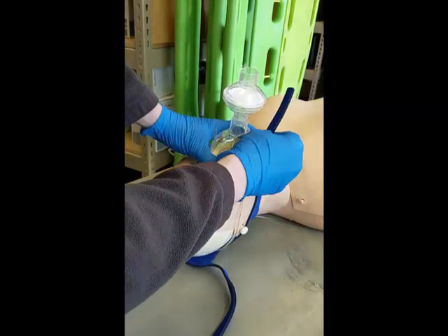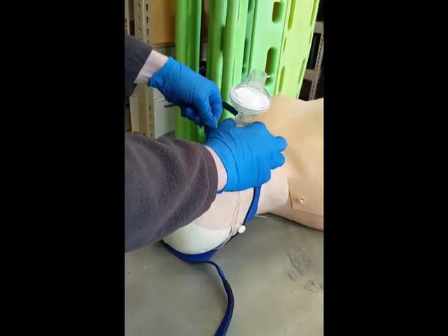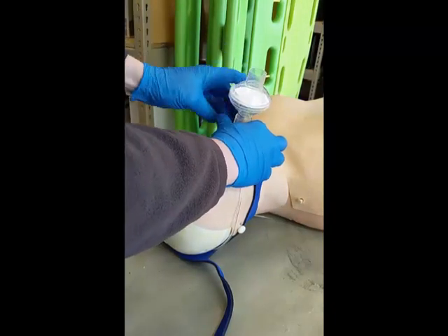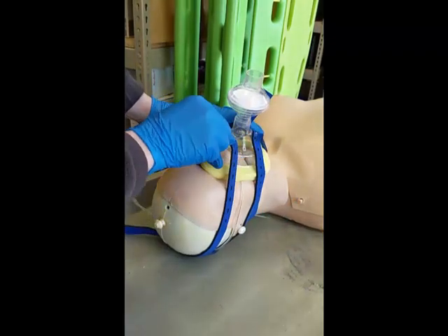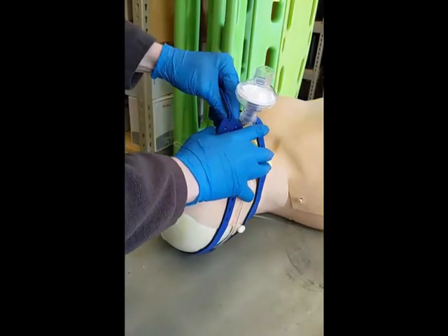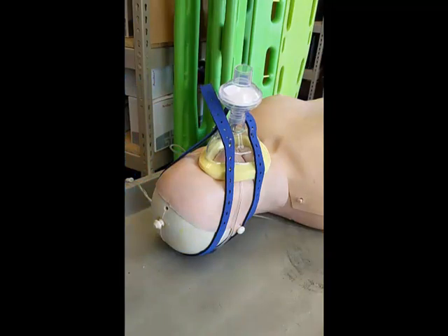The mask itself should be secured to the patient using the harness in the usual fashion, and ensure that the seal is good with the patient's face. At this point, the patient will receive oxygen. You can dial that up to the maximum liter flow of the regulator, and the patient is being passively oxygenated during chest compressions.